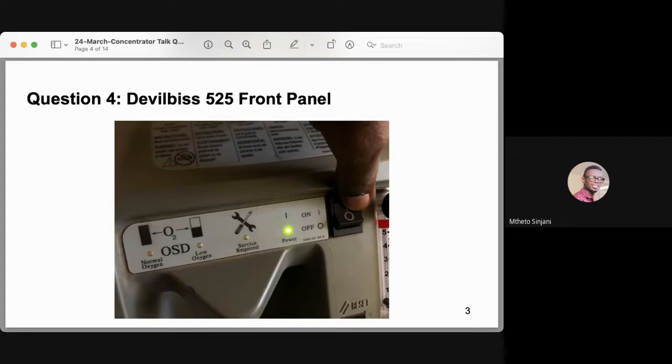The visible and the audible alerts will activate for approximately 15 minutes in a no power situation. If the unit is turned on without power, or the power is removed later, no alert will sound for the first 10 seconds.